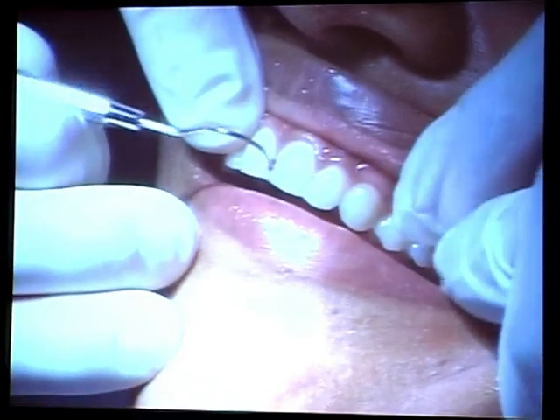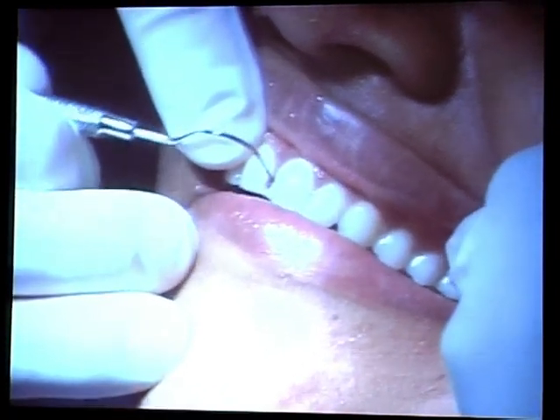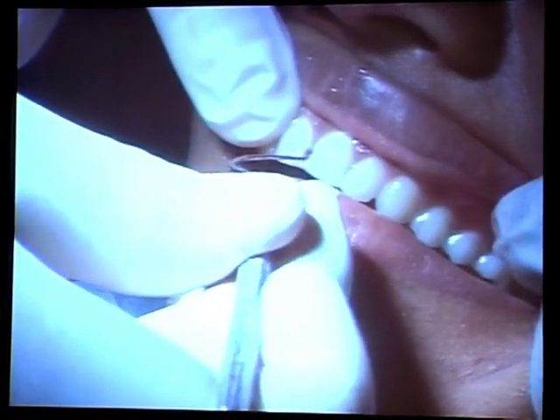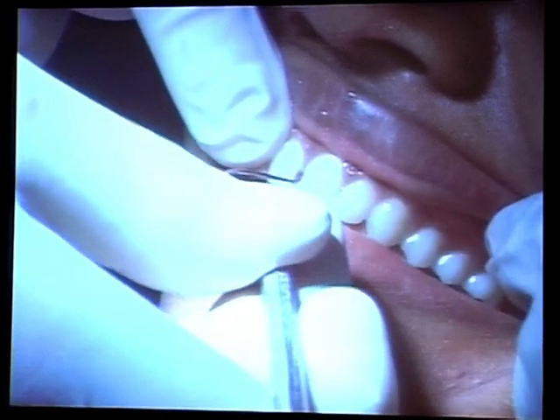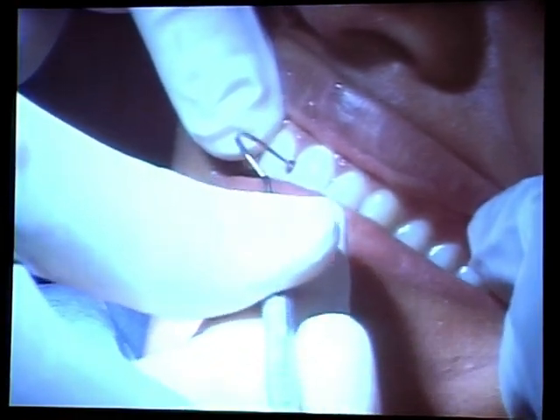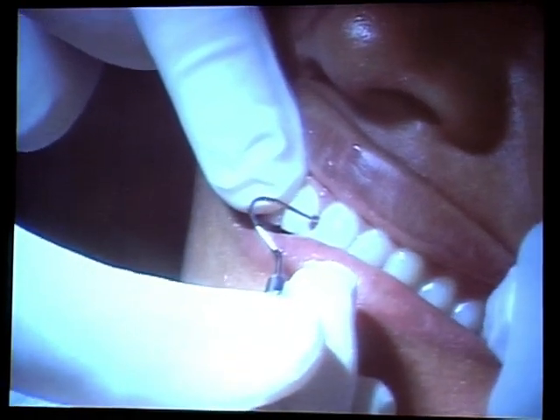And this, as you can see, is very minimally invasive. We are basically only removing the carious part of the dentine and the enamel. And we don't have to do any removal of the natural tooth structure, and we can manage it if you learn the technique of doing this properly.